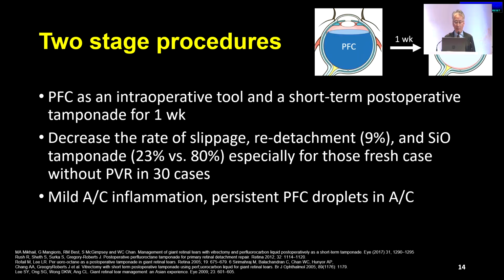So as Boomer already showed, if you leave the perfluorocarbon for 1 week, you will see some mild anterior chamber inflammation that can be easily controlled by topical steroid. And in the 30 cases, in one case I had a persistent perfluorocarbon drop in the anterior chamber.